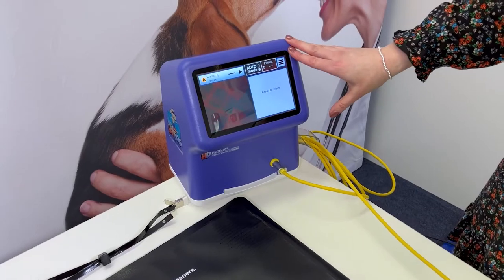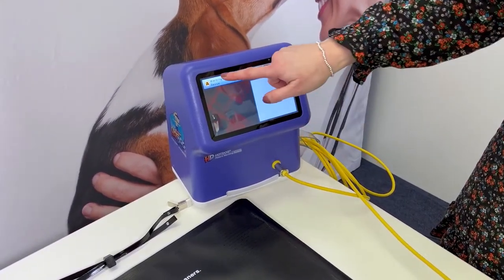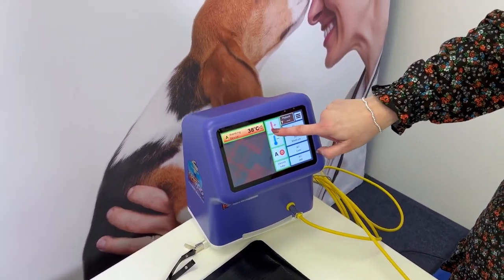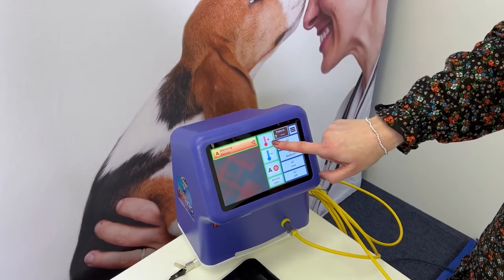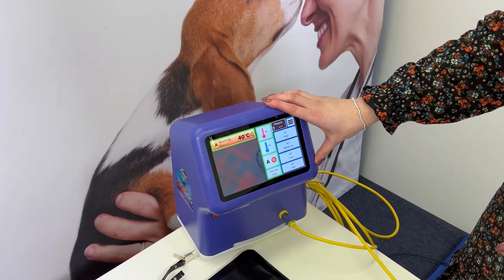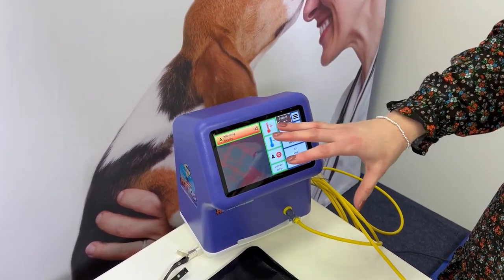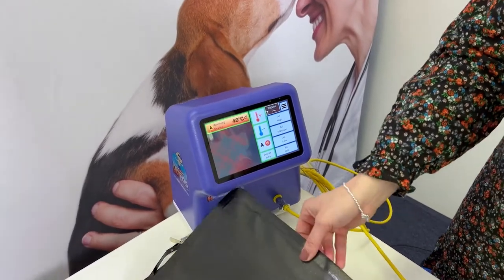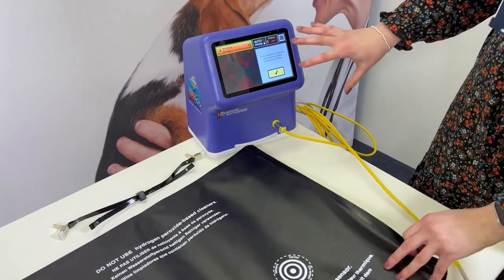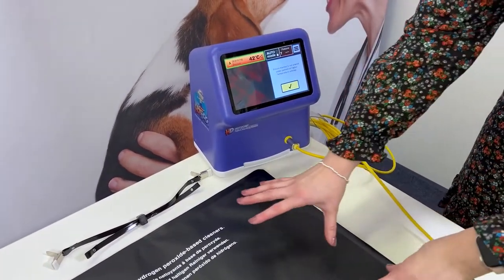The machine now says it's ready to warm. We only have mat A on this system. Select that, turn the temperature on, and we start at 37 degrees and can warm all the way up. If your patient requires treatment for hypothermia, it's recommended to start at 40 degrees Celsius. If you'd like to put the blanket over the patient, you can go up to 42 degrees, but you will be prompted to confirm you're not using the blanket at that high temperature while the patient is sitting on it.